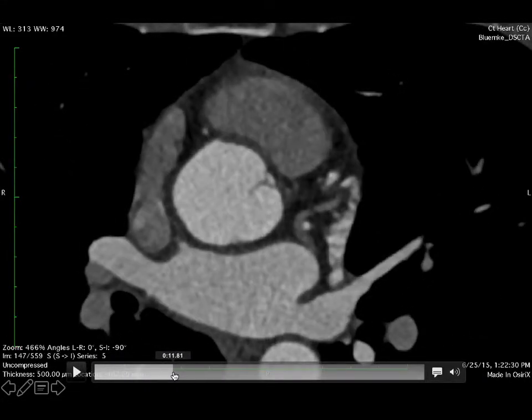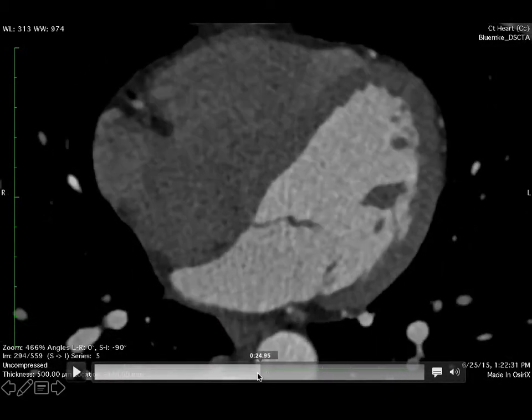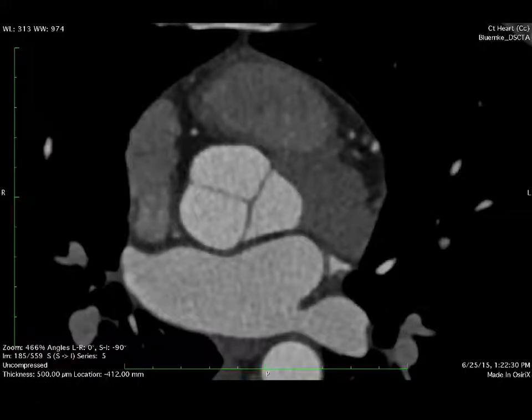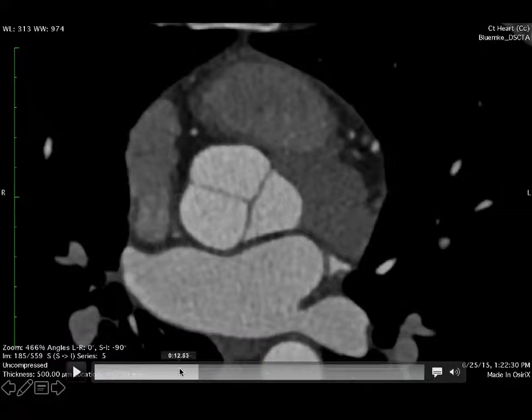So clinicians, when they're reading these, if you just look at this picture and say, well, does this compare at all with a SPECT scan? No. Does it compare at all with an echo? No. I mean, it's just a totally different fish, right? It's showing you different things. And so people have to learn how to read them.